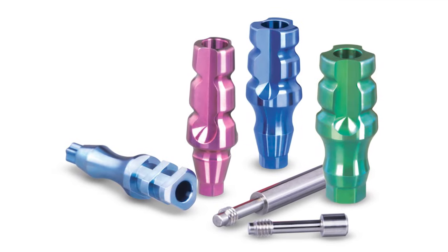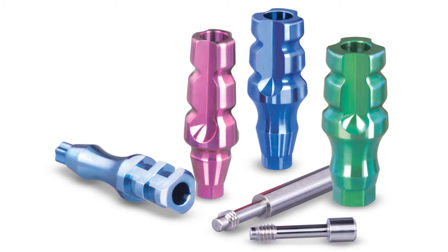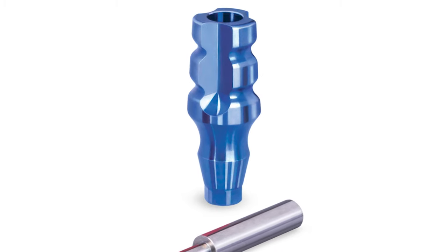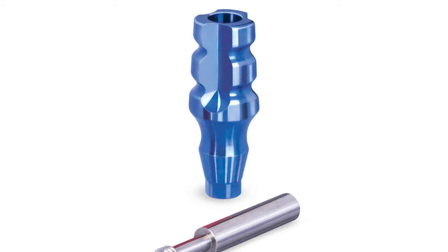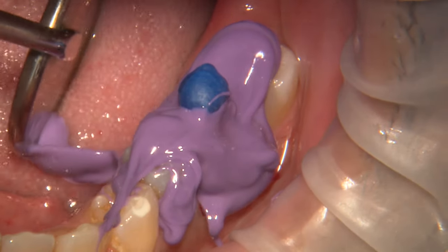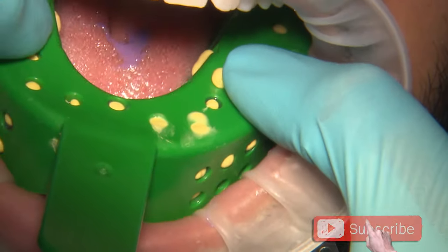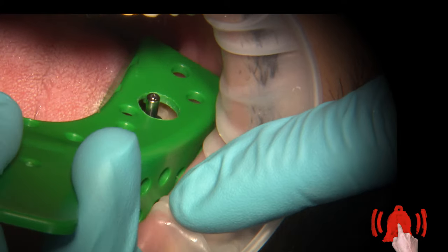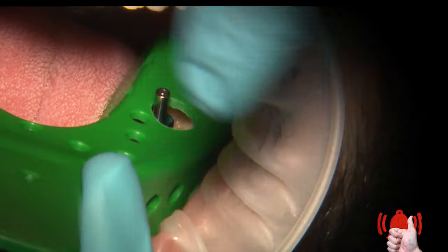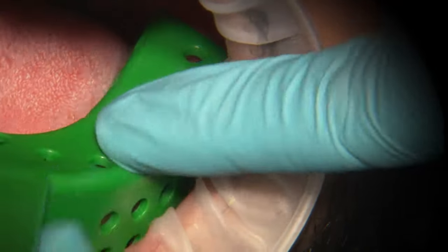Impression copings are used to transfer the position, angulation, and connection feature orientation of the seated implants when captured in an elastomeric impression. Impressions may be taken with either the indirect close tray or direct open tray technique, depending on the clinician's preference and chair-side conditions.